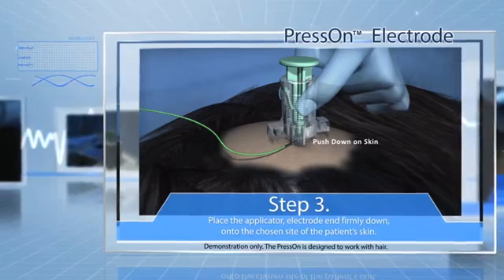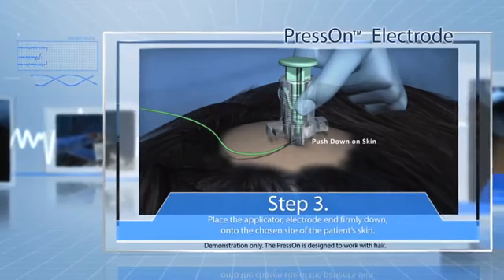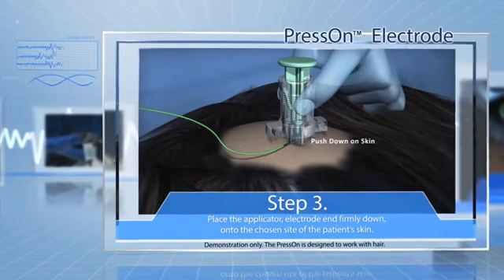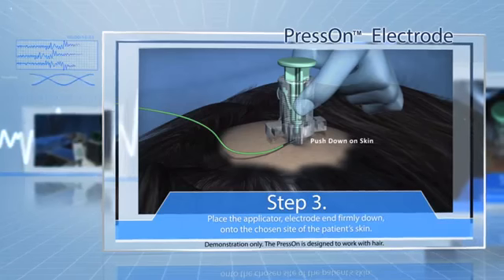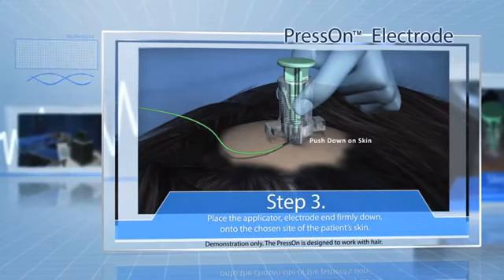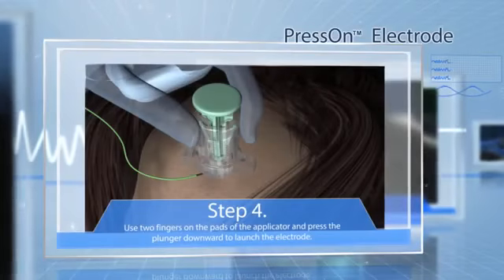Pay close attention to the direction of the lead wire exiting the applicator to ensure it is oriented towards the amplifier to avoid unnecessary strain on the electrode.